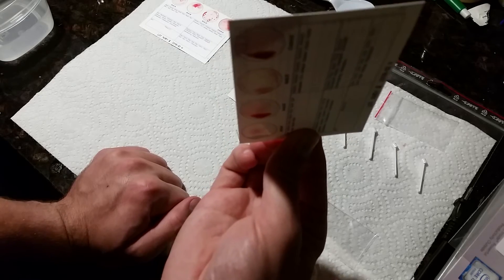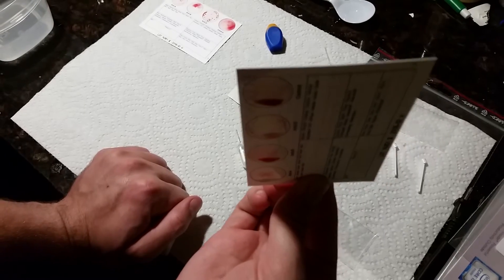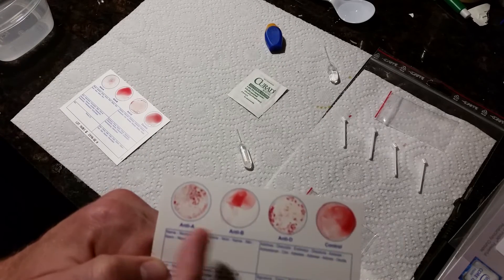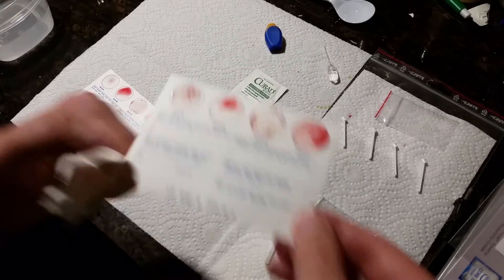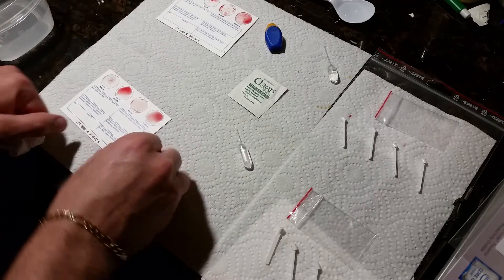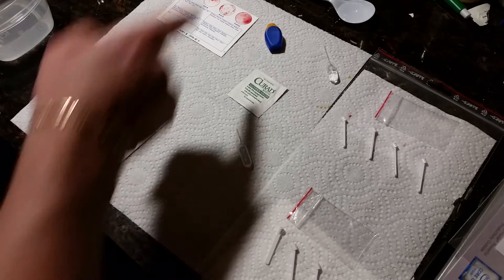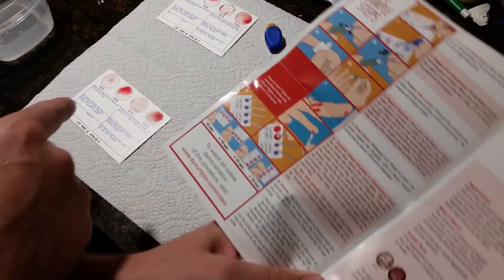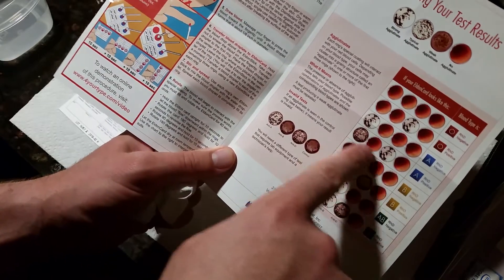My first card is dry and you can really see the granules clearly. Comparing both cards right now, they look exactly the same — granule, granule, solid, solid, granule, granule, solid, solid. That tells me my blood group is definitely Type A, RhD positive.